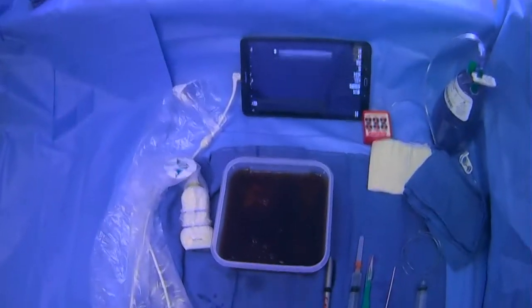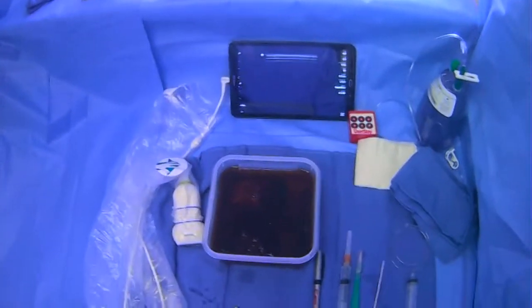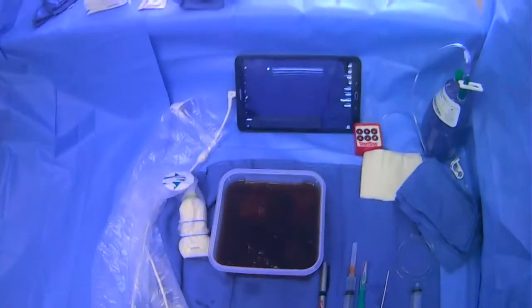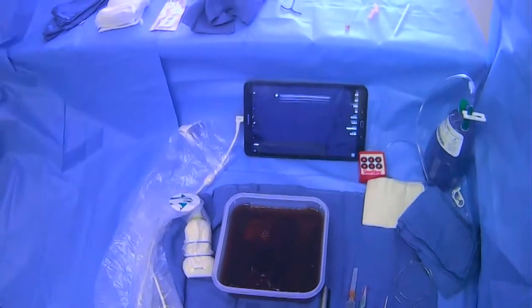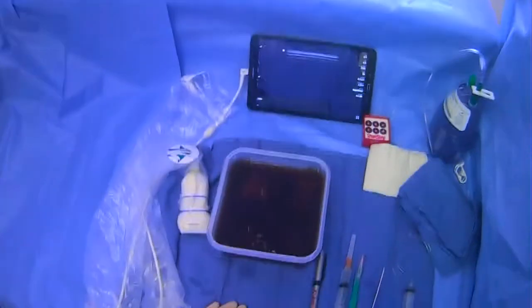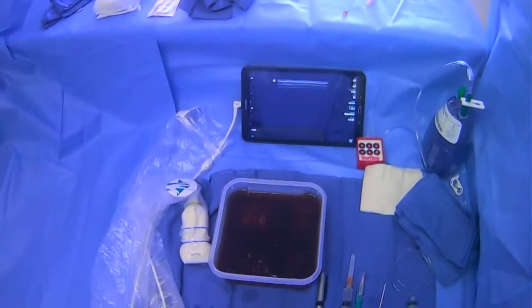We're going to do a quick overview about performing a paracentesis. It's important to realize that there are both diagnostic and therapeutic reasons you can do a paracentesis, so you'll want to keep that in mind — why are we doing it, what are we going to send for analysis, and are we going to do a large-volume paracentesis?